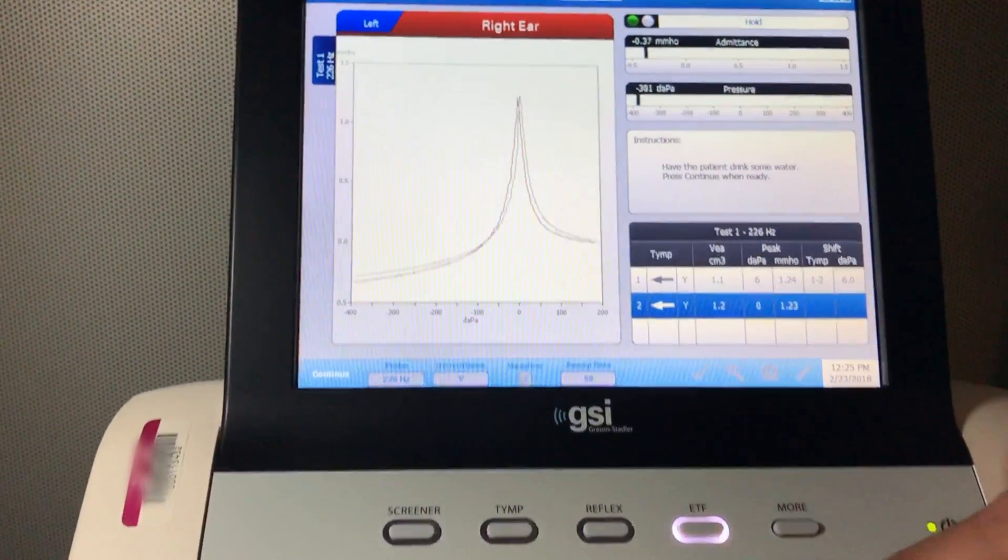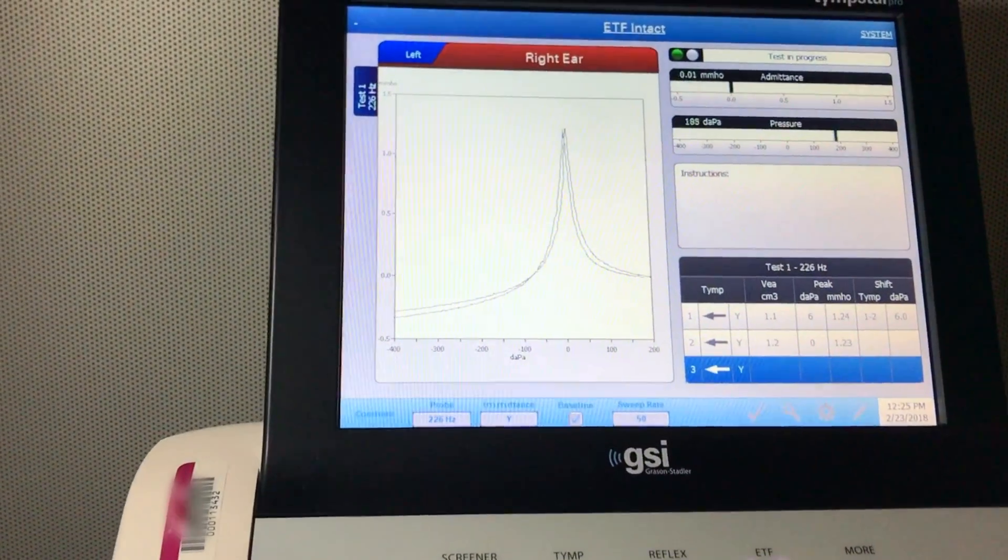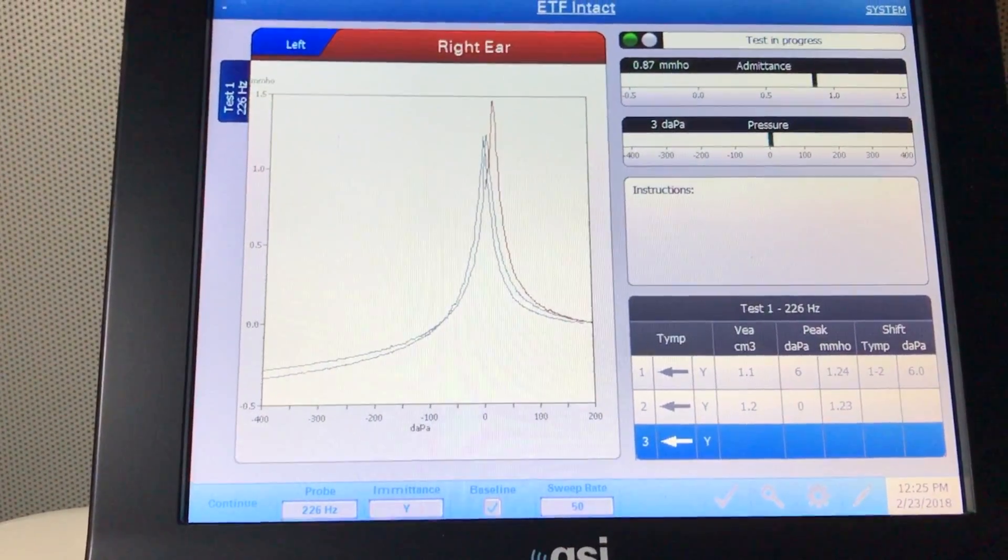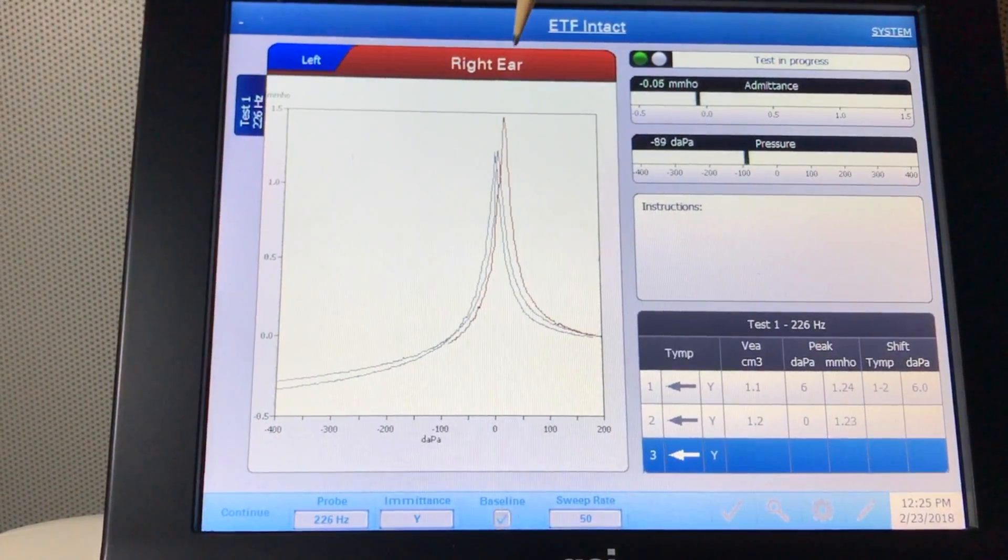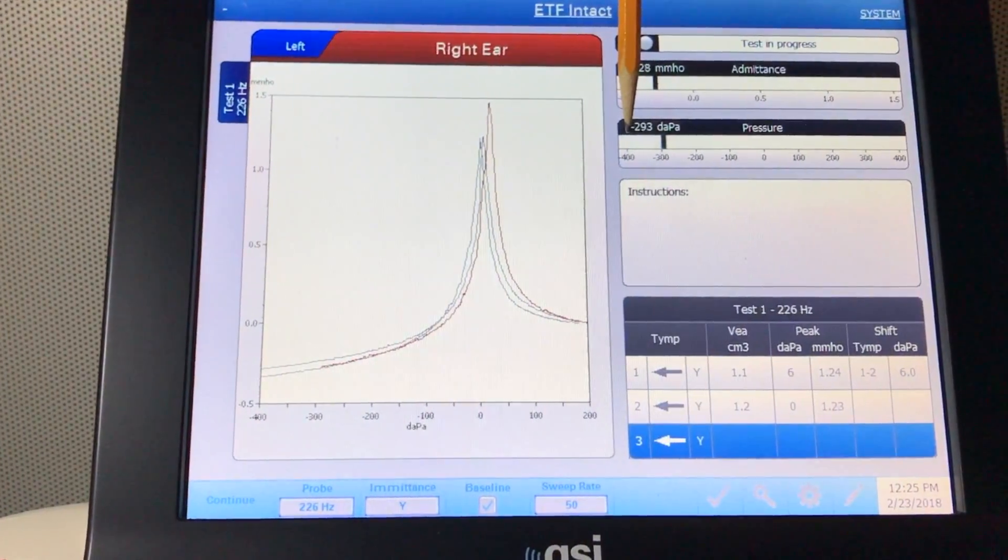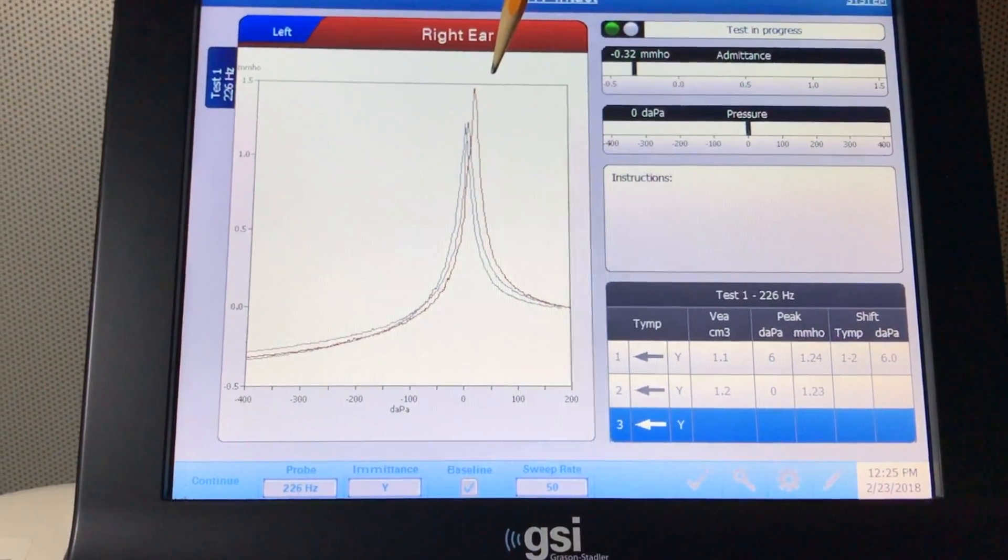So repeat it again. Get the third baseline tympanogram. As you can see now, the peak is shifted to the positive side. By creating a negative middle ear pressure and having the patient drink some water, it shifts the middle ear pressure to the positive side. So you have three peaks.